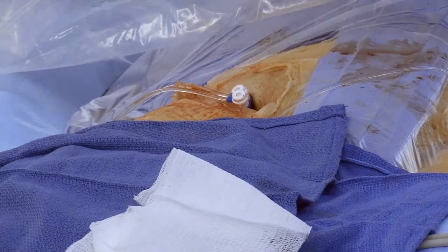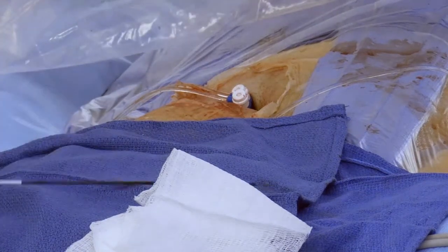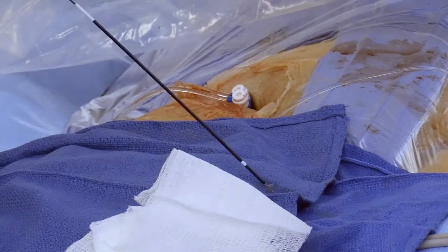Always close the most proximal site on either leg first when multiple sheaths are in the same vein, to ensure the distal catheter does not interfere with the disc of the Vascade MVP.